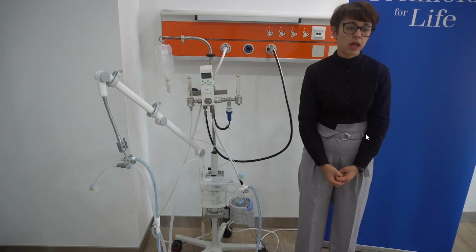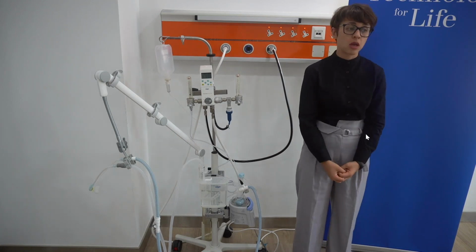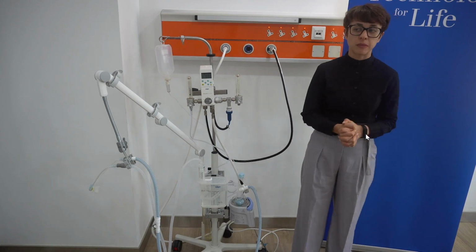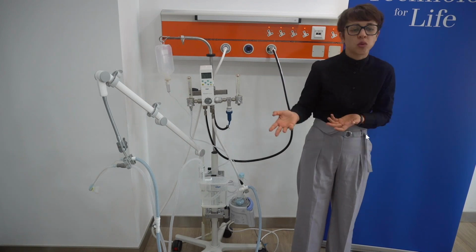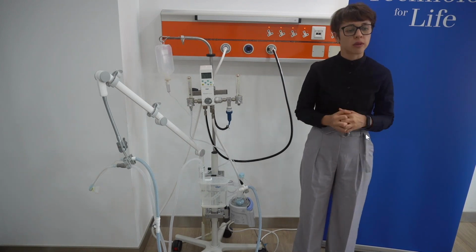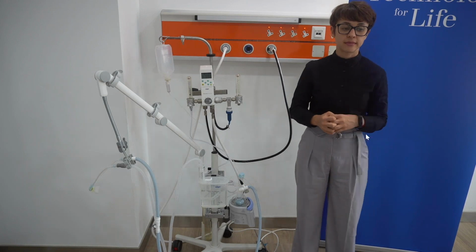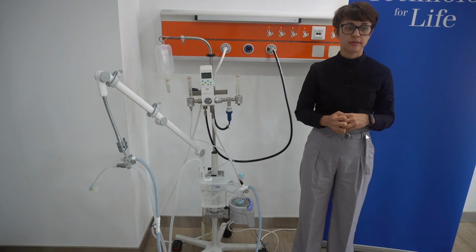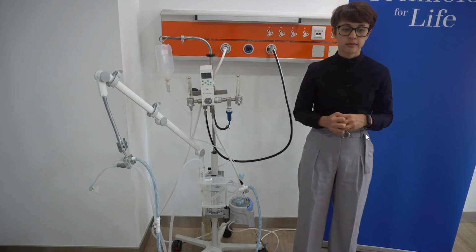And similarly, in the bubble CPAP we also make the recommendation, and I think it's regardless of whether it's bubble CPAP or any other CPAP system, generally between 6 to 8 or 5 to 8 liters per minute. I would agree with that. And that's why high flow nasal cannula is also starting to take over a bit in that field, because we also run that between 5 and 8.